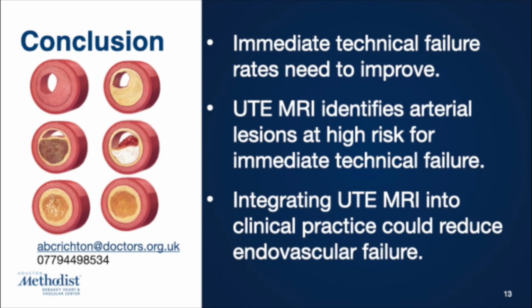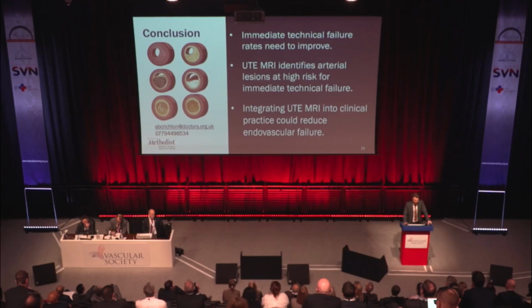So the take-home messages are that we need to make advances in immediate technical failure, and we need imaging that can guide us and identify these lesions that are at high risk. And ultimately, I believe that we need to integrate this into our clinical practice and integrate this into device development before you receive these kind of devices, so they're safer practice and so that we can reduce endovascular failure. That's all from me, everyone.